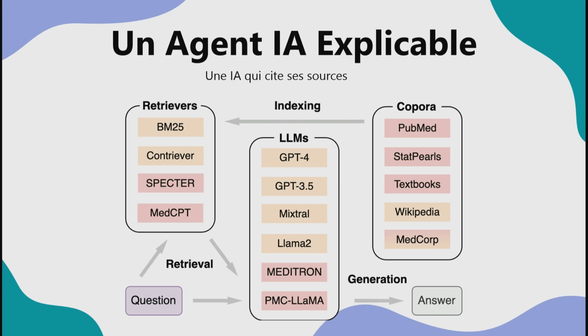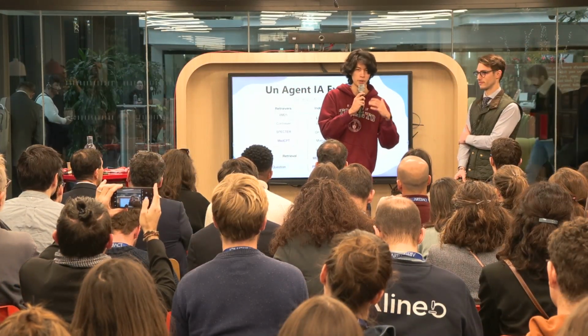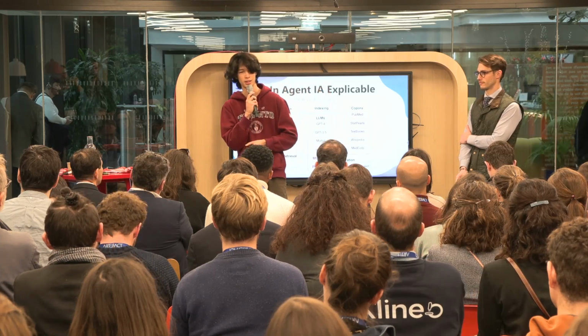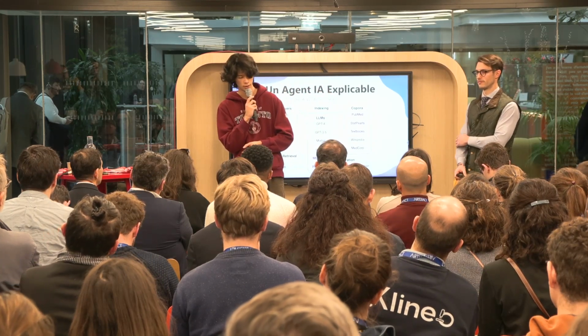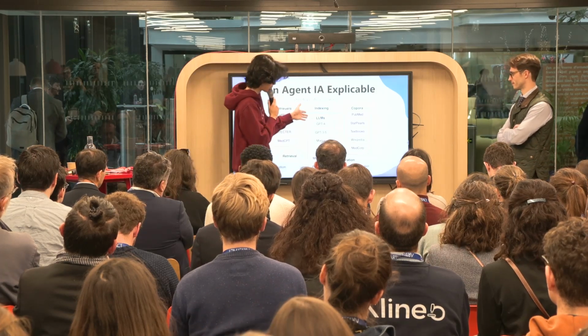And then something else that we want to do is also be able to take those very complex specialist reports and make them more accessible for patients by breaking them down, explaining all the technical terms, explaining or vulgarizing different observations by the doctor. And so how do we do that? Well, it starts with a big language model.